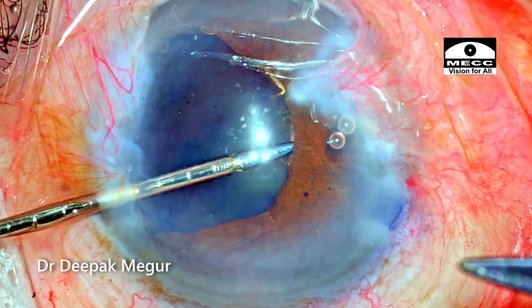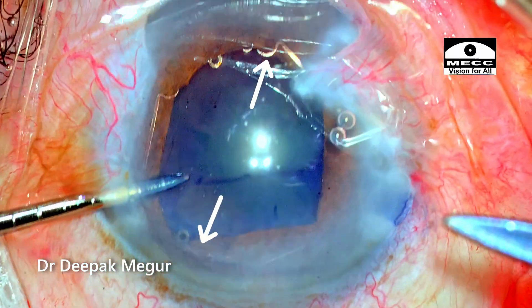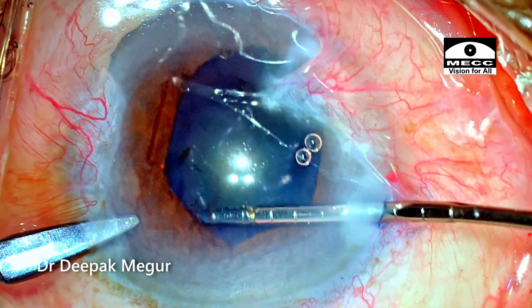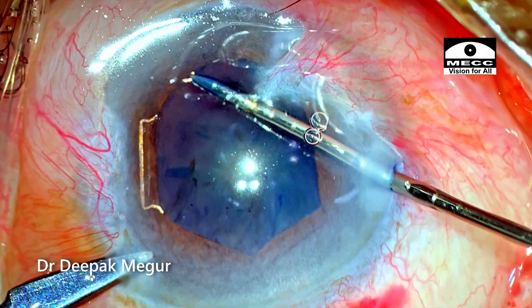It is tricky to place the B-hex ring when the pupil is quite well dilated. Part of the notches have disengaged, so I come back and re-engage these notches. I'm now certain that all the notches are engaging the pupillary margin.